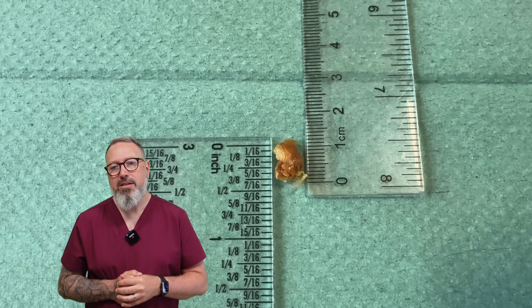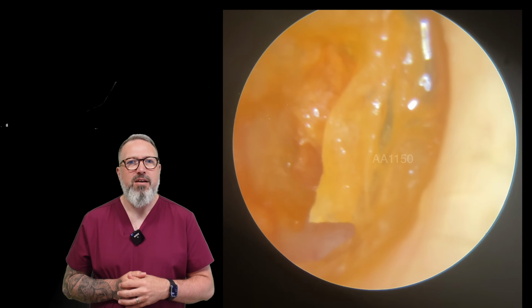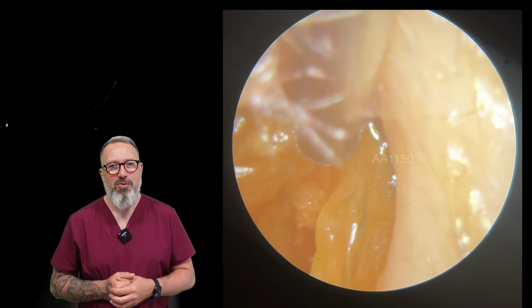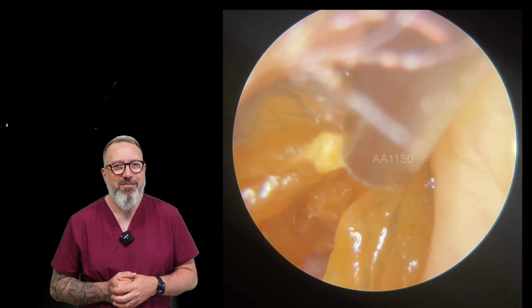Taylor's patient is coming up next. So let's see what Taylor's got for us today. Ooh, a very thick, dry skin layer. Now this is going to go one of two ways. Either it's all going to come away really easily and all stays one big chunk, or he's going to have to work and strip every bit of dry skin off this canal wall.